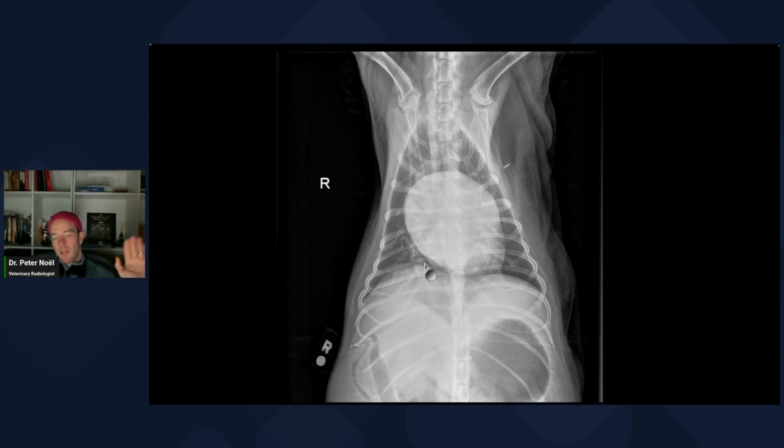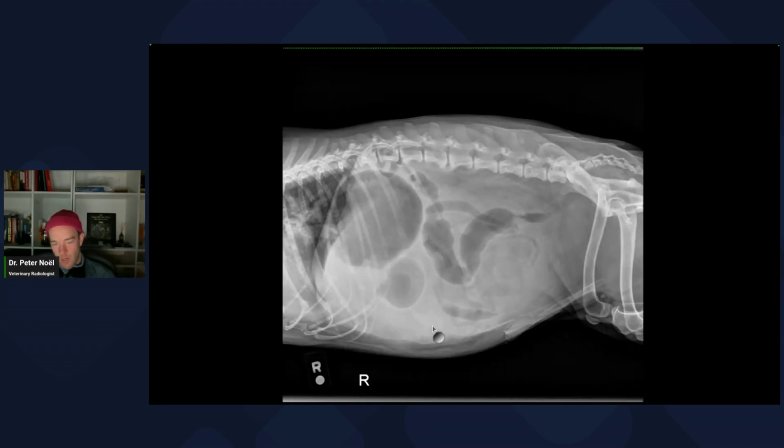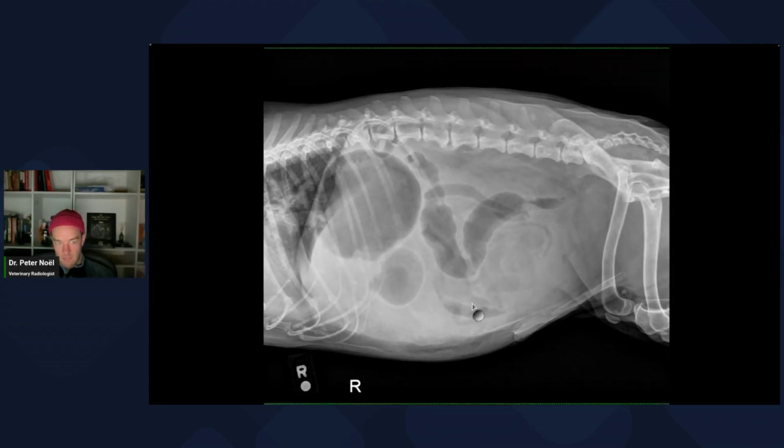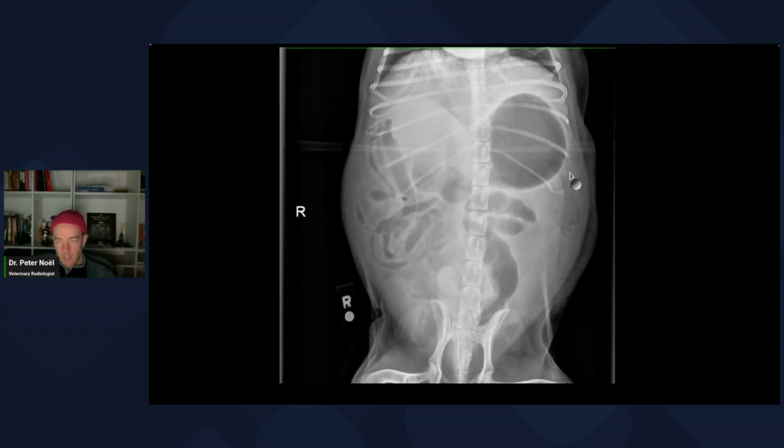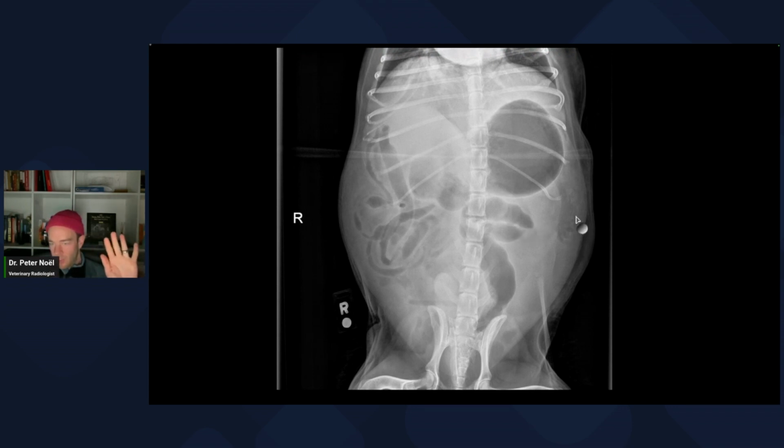The next one, I'm very sure, if I can just click with this internet, this dog has peritoneal effusion. You just can't see the margins of anything. I don't really see the urinary bladder. You can't see the margins of the liver. You can't really see the spleen. And then you've got this heterogeneity over here. If you look at the VD view of the abdomen, there's a lot of it. Look at all that wispiness. This belly is full of fluid, and this wispiness or heterogeneity can help you feel more confident that it's fluid.